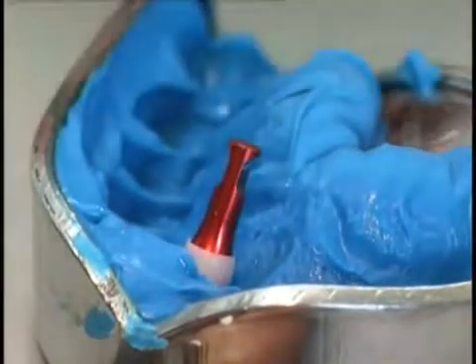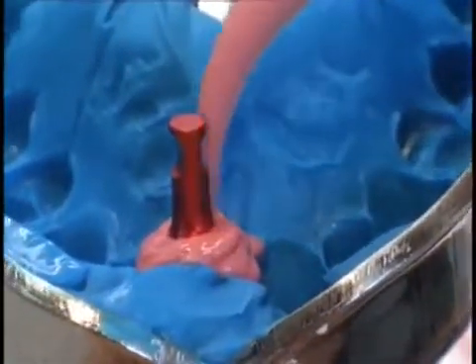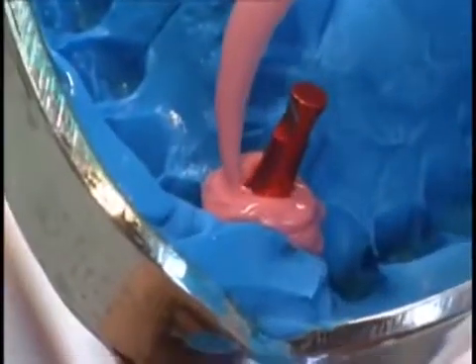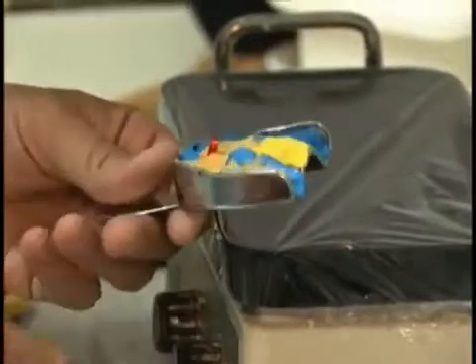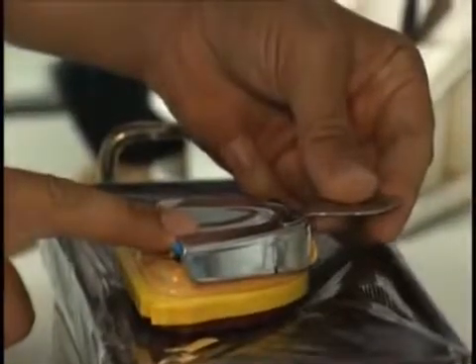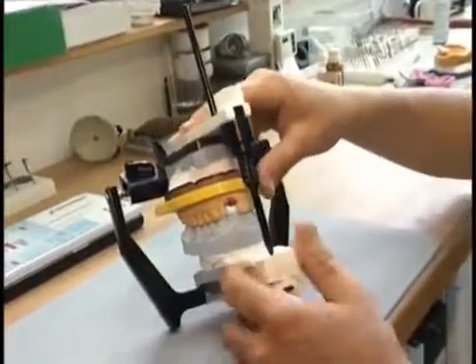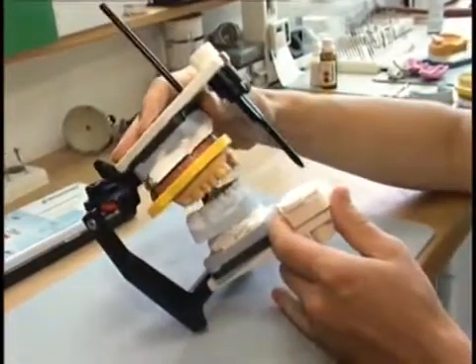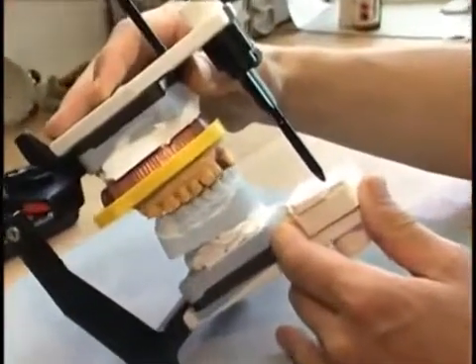A gingival mask should always be used to achieve an optimal cervical crown contour. The working model is created as usual using dental stone. This is the completed working model with the implant analog and the gingival mask. After checking the clinical situation on an articulator, the abutment can now be selected.